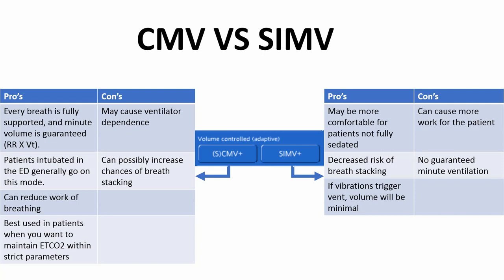SIMV can be a good mode for pre-hospital, as long as you dial in another setting that I'm going to show you on the ventilator. But the good thing about SIMV is we're in an environment where there are a lot of vibrations, and depending on your sensitivity that you set, which your sensitivity is just how easy or hard it is for that patient to interact with the vent and tell the ventilator that it wants a breath. If your sensitivity is set too low, then vibrations can trigger a breath even if the patient didn't do it.